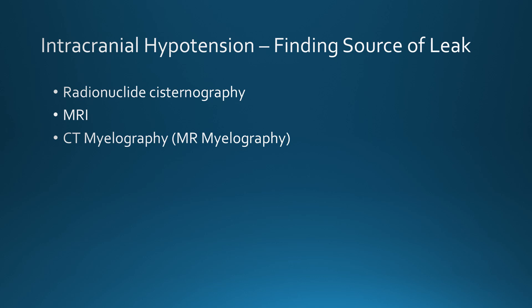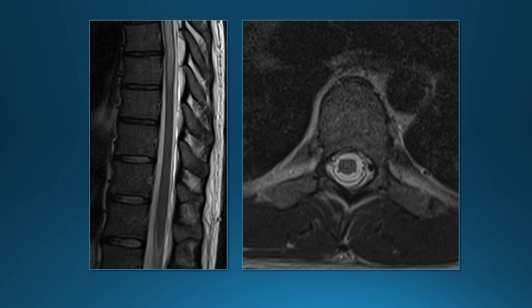We try to find the source of the leak. This has been done with radionuclide cisternography, although it's not used very often. MRI is helpful if there's a very fast leak — we can see extradural accumulation of CSF. The mainstay is CT myelography, and we sometimes also do MR myelography. Probably about half the time we're not able to find the source of the CSF leak. On MR, patients with a fast CSF leak can have extradural accumulations of fluid — this line is the dura, and this is an extradural accumulation of CSF outside the dura.